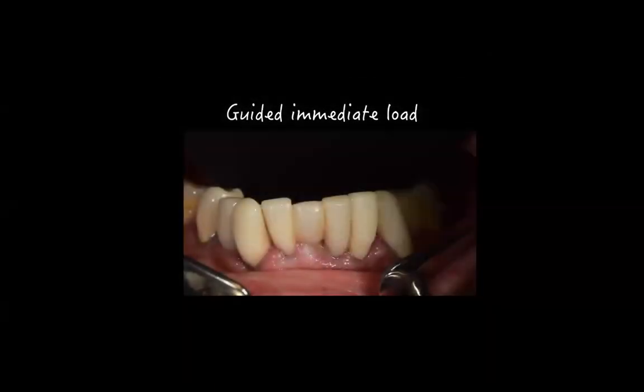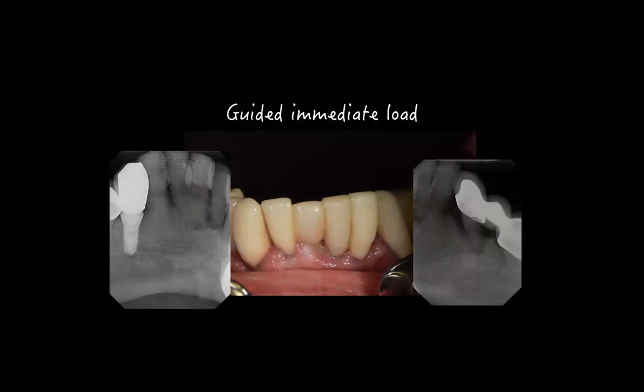So let's move forward and take a look at a case. From here on, we're going to touch upon different cases and whatnot. But here is a patient of mine. She is probably at this stage 84 or 85 years old. I have done all her implant cases in her mouth, and she comes in with lower anteriors. And I generally like to keep the lower anteriors for the older patient with just simple splinting and not take them through a vigorous treatment plan.